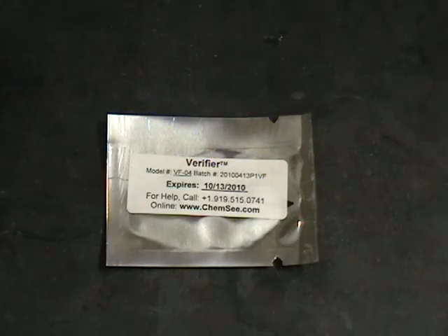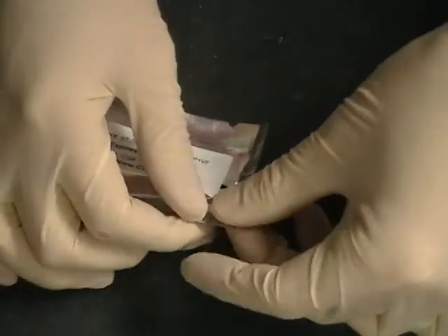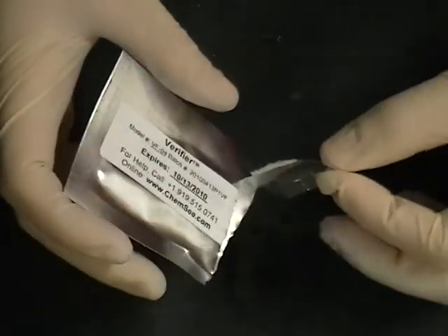Each verifier comes packaged in a small foil bag. To remove the verifier, carefully tear open the bag at the notches and remove the detector from the bag.